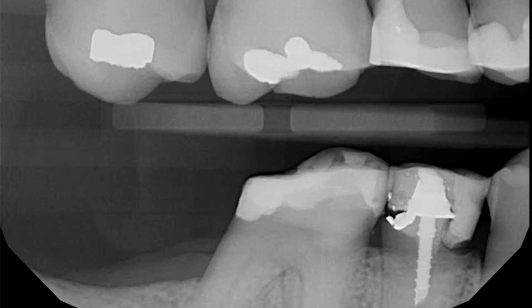So upon removing this post and restoration complex, this tooth is going to basically be down close to the gum line. In terms of gaining some sort of a restoration on this tooth, we will be impinging on this patient's biological width. And so traditionally the option in this sort of a case would have been to perform some sort of crown lengthening surgery in order to not impinge upon the patient's biological width and provide this patient with not just a restoration but also a stable and healthy periodontium.